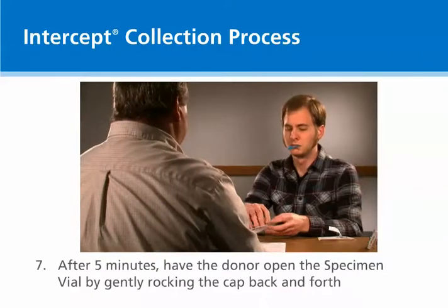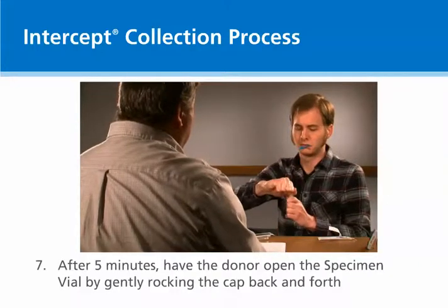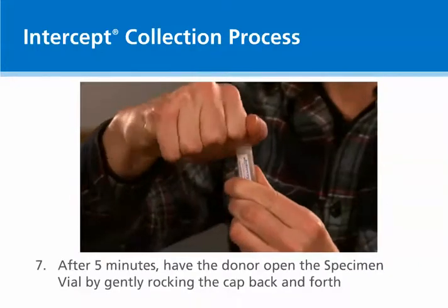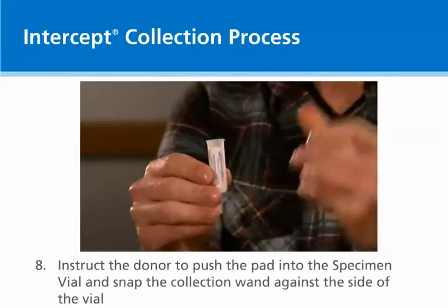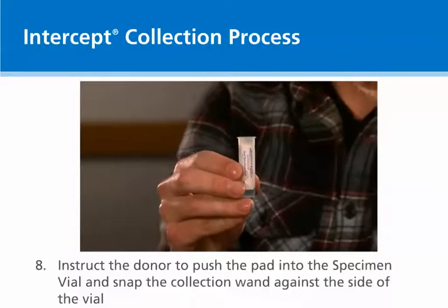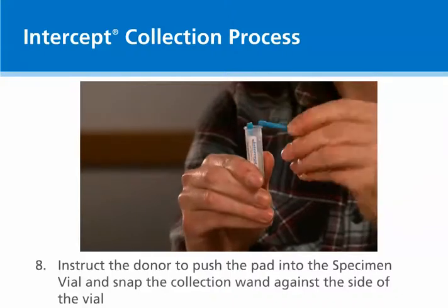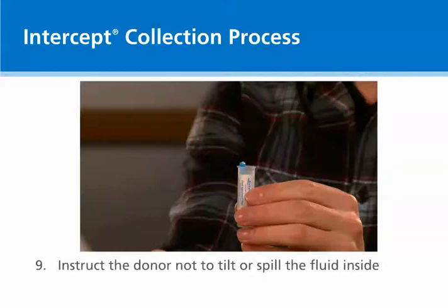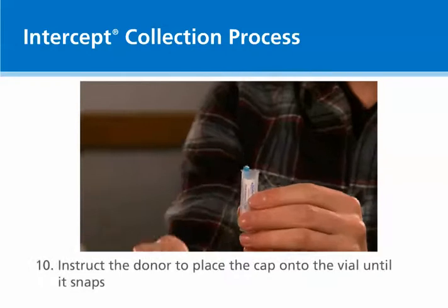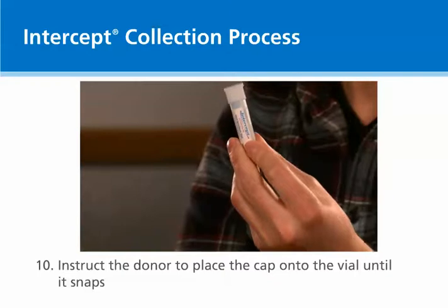After 5 minutes, have the donor open the specimen vial in an upright position with the tip pointed downward by gently rocking the cap back and forth to avoid spilling the contents. Then, instruct the donor to push the pad into the specimen vial as far as it will go and carefully snap the collection wand against the side of the vial. Instruct the donor not to tilt or spill the fluid inside. Instruct the donor to place the cap onto the vial until it snaps. This will ensure a secure fit.